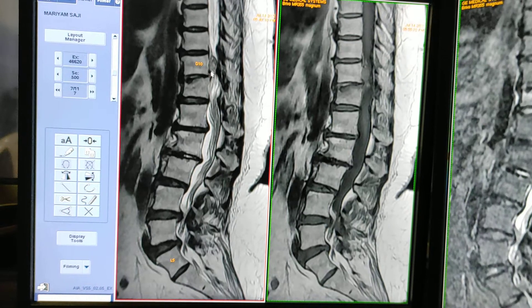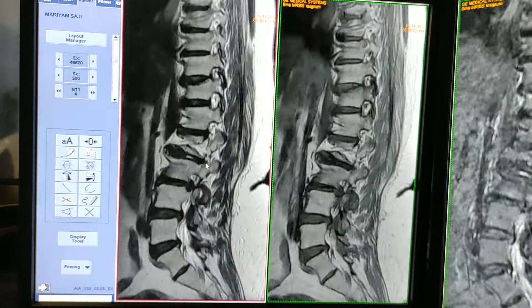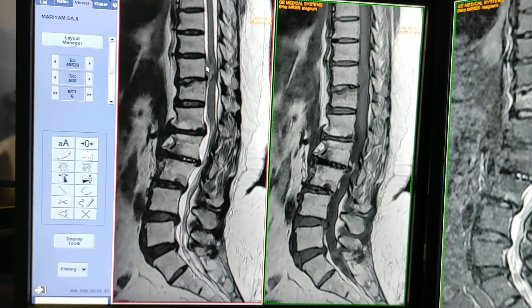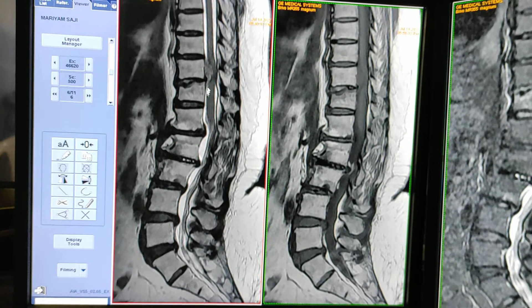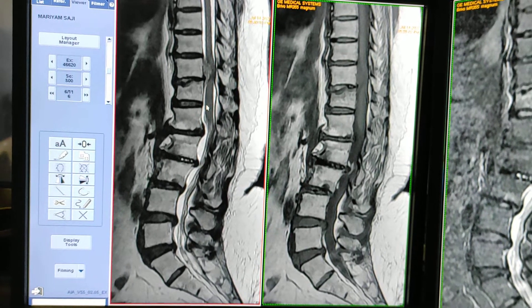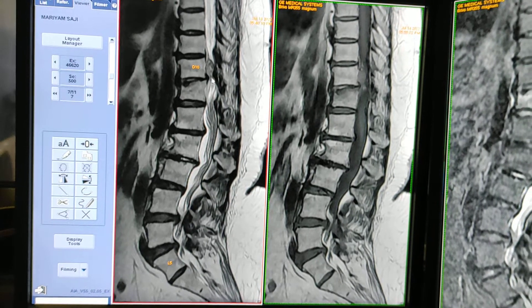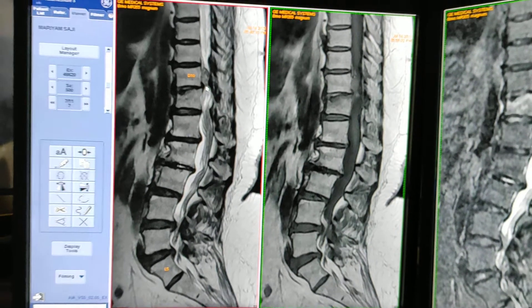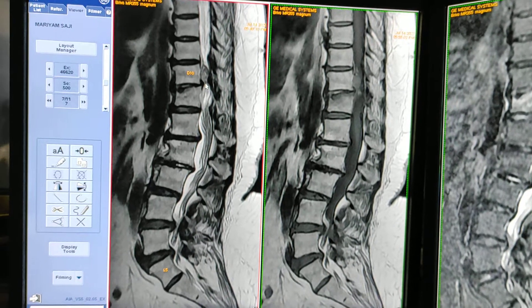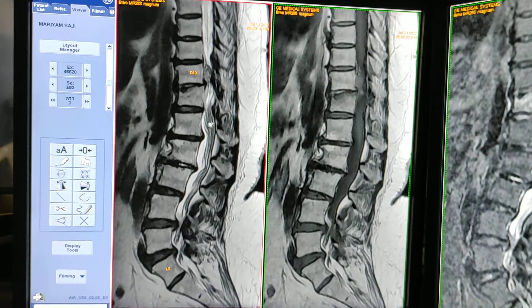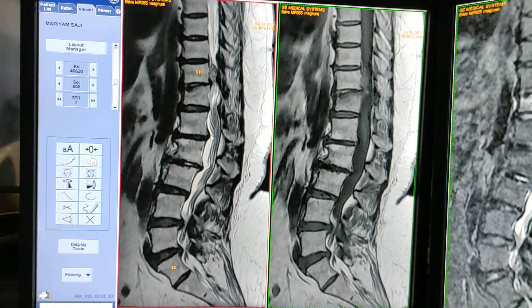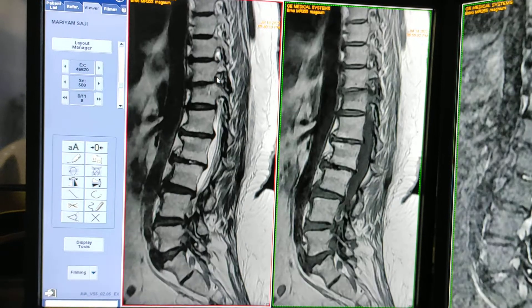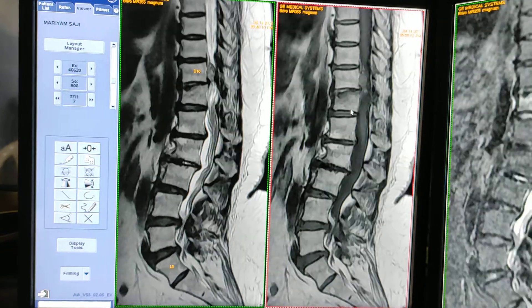The first sequence is T2. Going right to left, this is the lesion — it is T2 hyperintense. In such cases you should use contrast. For differentiating meningioma versus neurofibroma, you need to see how the enhancement comes after contrast.